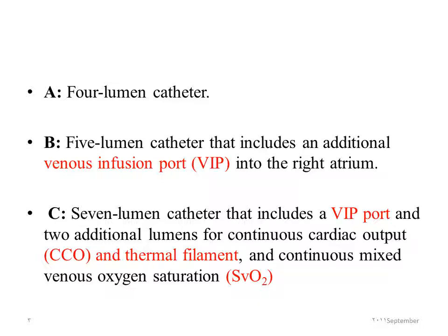There are different methods used to assess pulmonary artery pressure. We can use different catheter types: 4 lumen catheter, 5 lumen catheter.